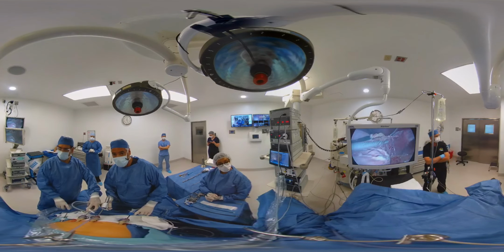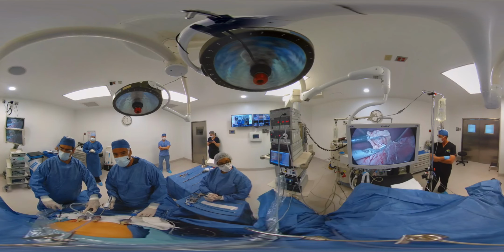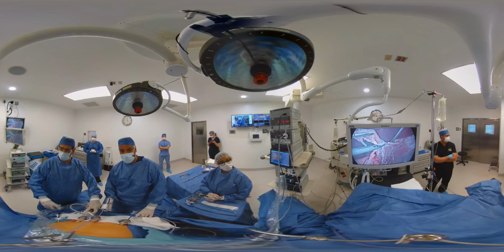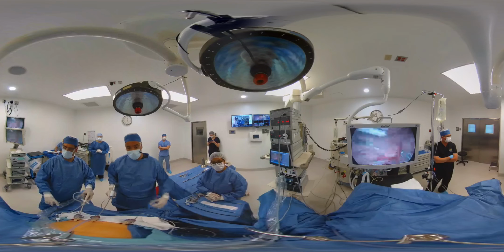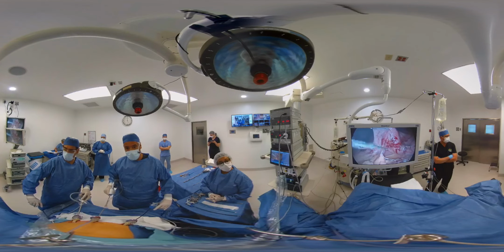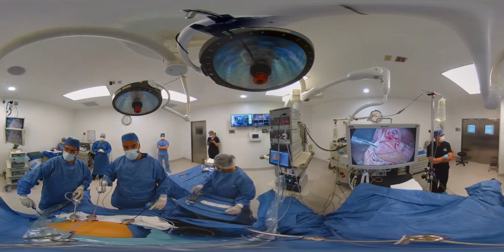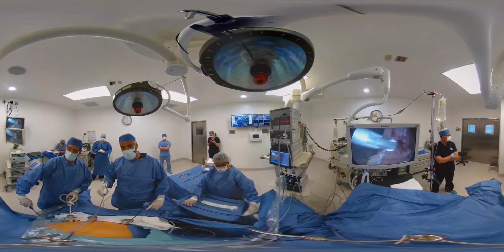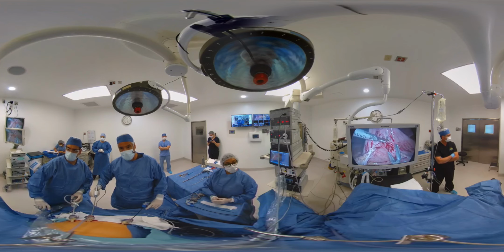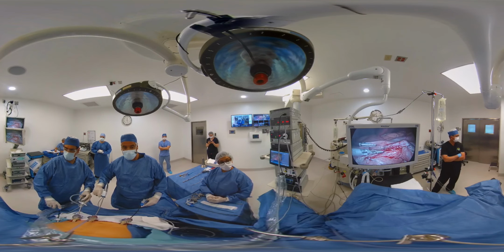Now, I'm going to pause for a second as soon as I remove this fat, and I'm going to show you the patient's anatomy. As you can see, if you look down on your device or on your computer screen, or even if you're using goggles, which has got to be a trip, you will see that I'm between the patient's legs. My surgical partner here is on the side, moving a camera and the instruments. And the instruments are going through some one-way portals where the instruments can come, but the gas remains inside the belly. And the reason is simply because we want that gas to inflate, to lift the abdominal wall.